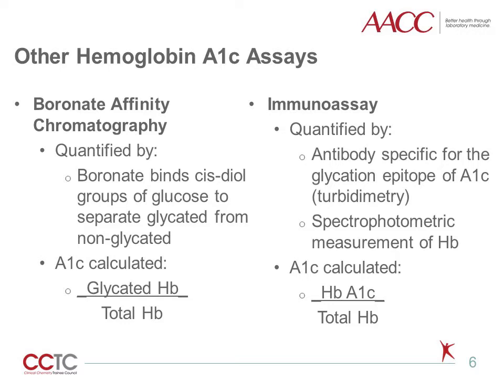Both of these methods often will report a value, even when the chromatographic methods will not. However, the accuracy of these reported values is questionable in the cases where hemoglobin A1c values could be falsely low due to increased red cell turnover, as is the case in sickle cell disease and sickle cell trait patients. For more information on this, please refer to Strickland et al.